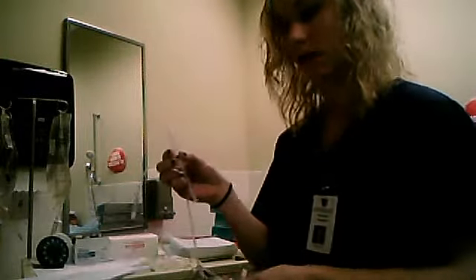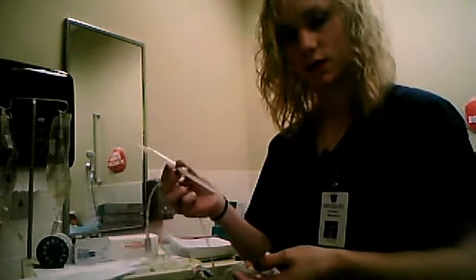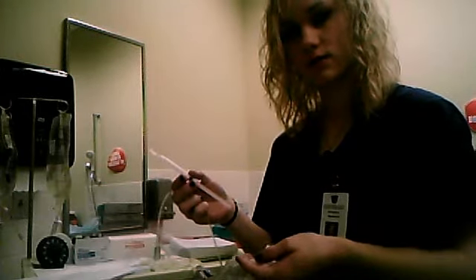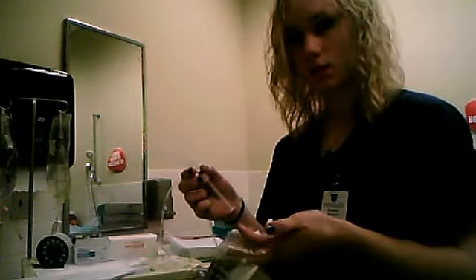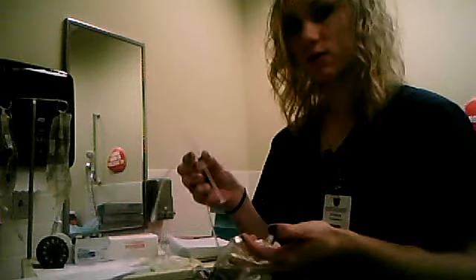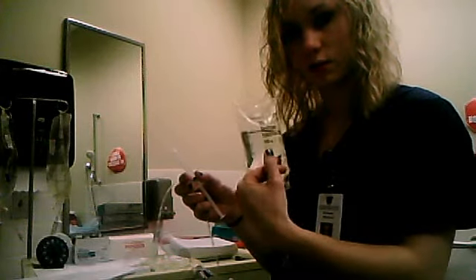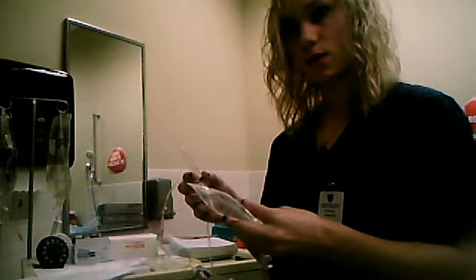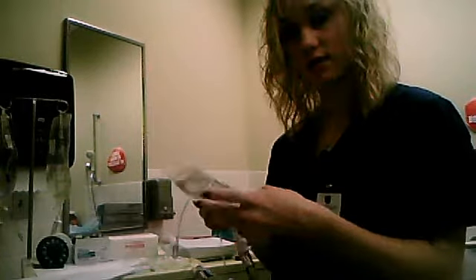But before I can do that, I need to have a second RN double check this. She's confirmed that it's okay, so we've got our 5 rights out of the way. We've got the right patient, Pat Smith, the right drug, Amiodorone, the right dose, 3 mils injected into 100 mils of normal saline or D5W. We've got the right route, which is an infusion, and the right time, which is stat.